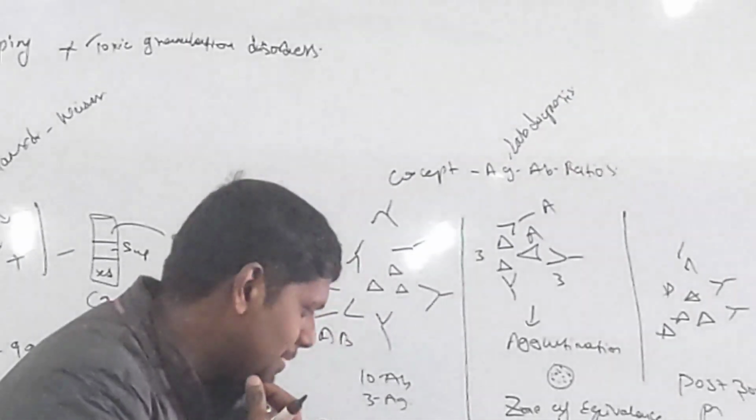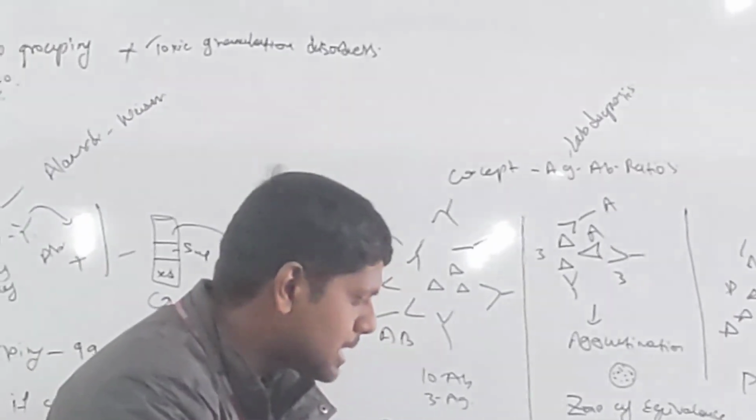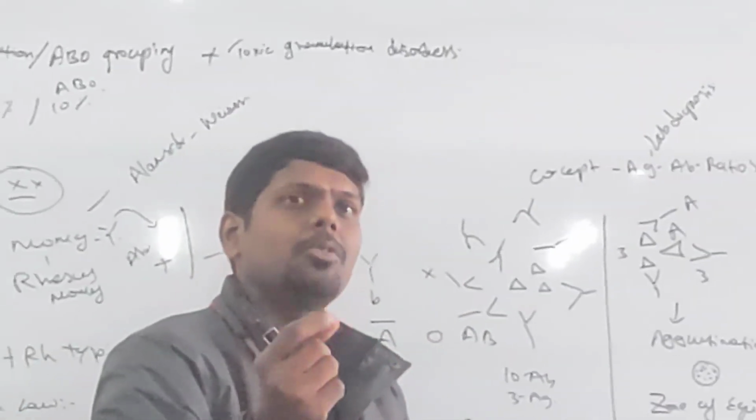Yeah, but chances will be less. Since anti-sera already added, now I'm just adding blood. Yes, sir. Blood mixing won't happen.